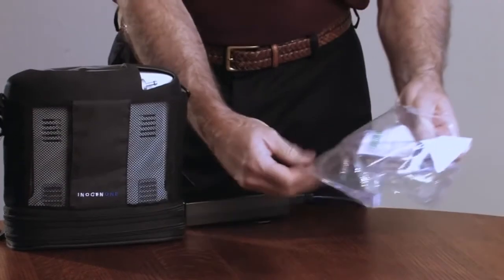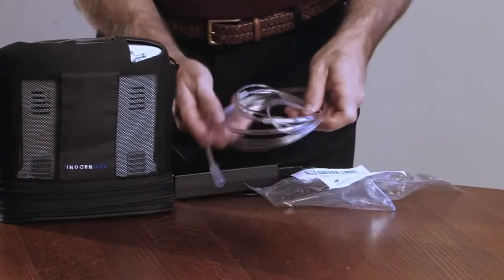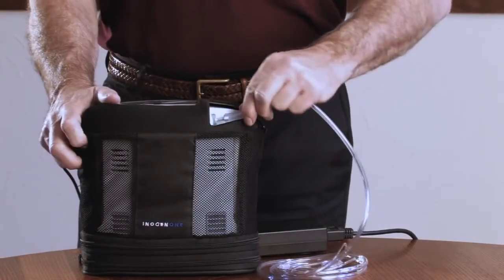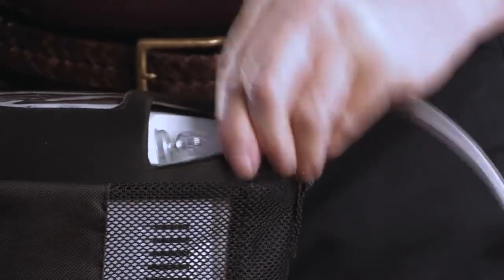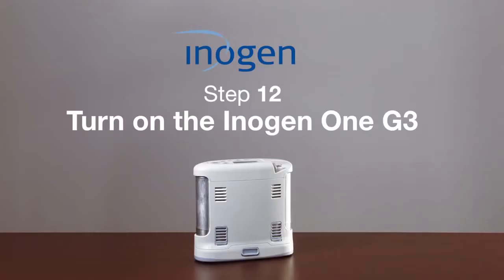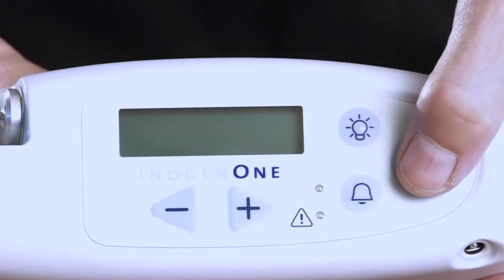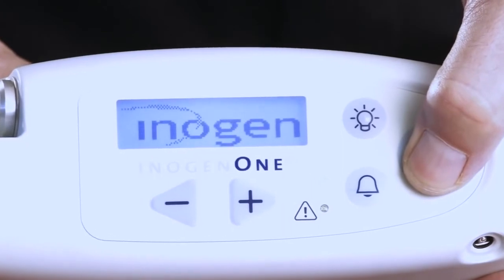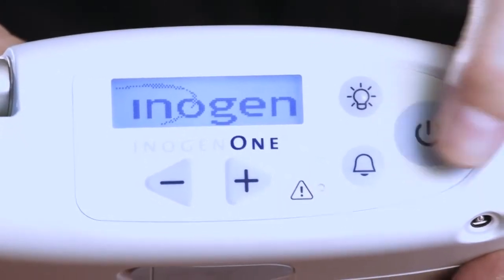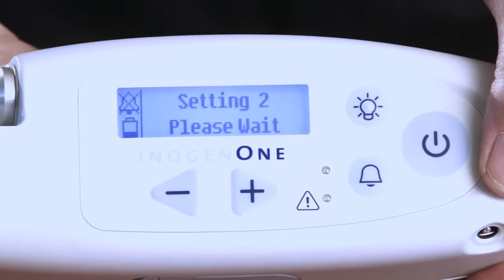Now you can connect the nasal cannula tubing into the metal nozzle on your Inogen One G3. Oxygen will only be delivered while you are breathing through the nasal cannula connected to the device. Turn on the Inogen One G3 by pressing and holding the on-off power button until you hear a beep and/or see the display screen turn on.